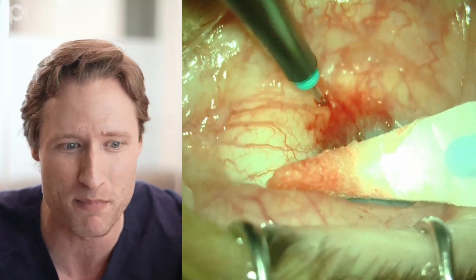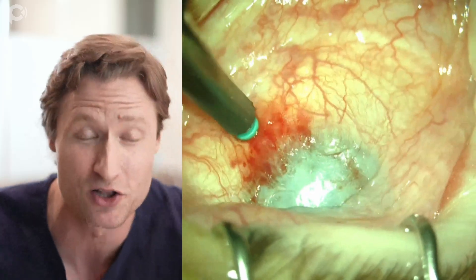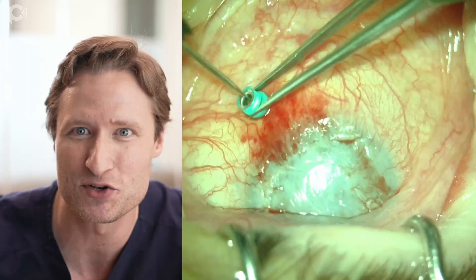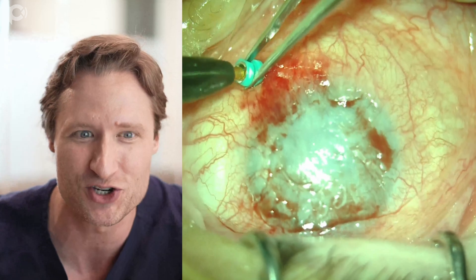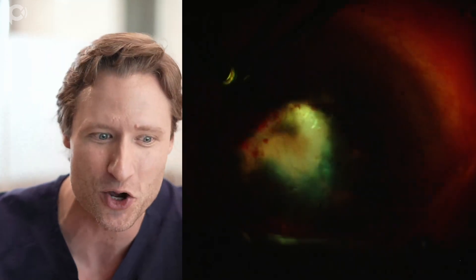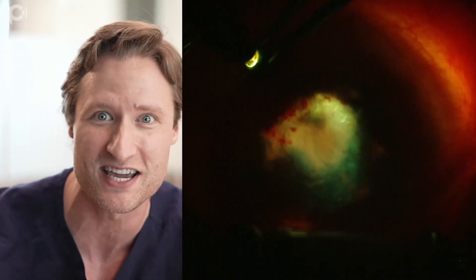That doesn't help much. But the next thing I do is I place a chandelier illuminator. Chandelier illumination for DMEK was a concept described by a Japanese ophthalmologist, Takahiko Hayashi. Look what happens when you plug the chandelier into the eye - you turn the light on, you turn the microscope light off, and immediately you can actually see into this eye.